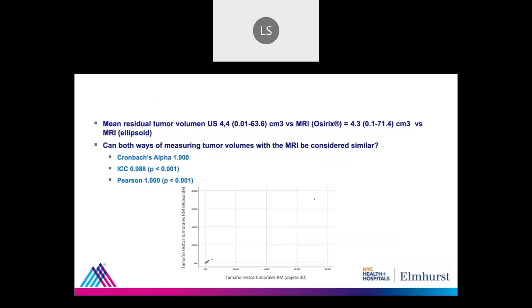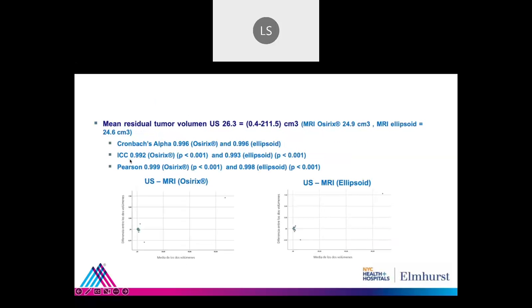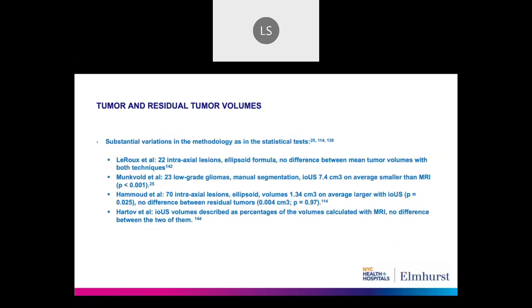And it was pretty much the same for the residual tumors that we measured, pretty good coefficients. Same here. And then, something that I looked at in the literature is whether it has been described before: what's the difference between measuring a tumor volume with the MRI and with an ultrasound.